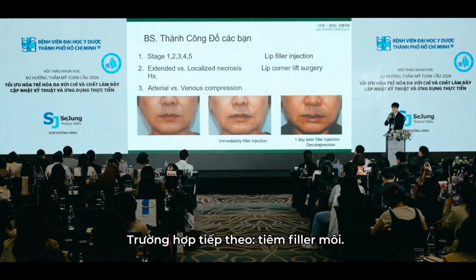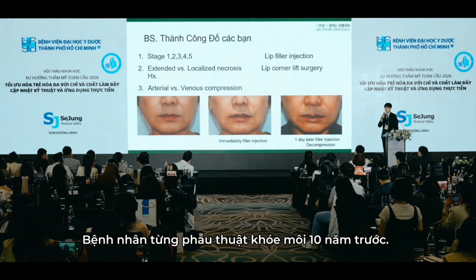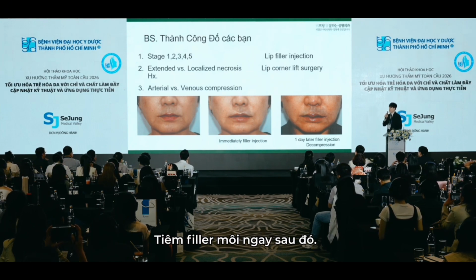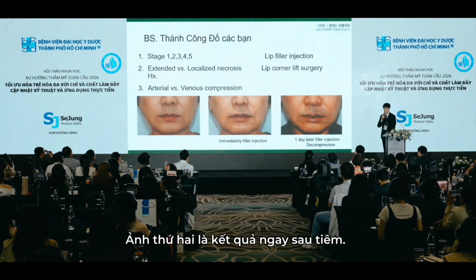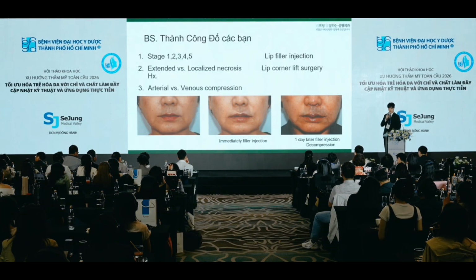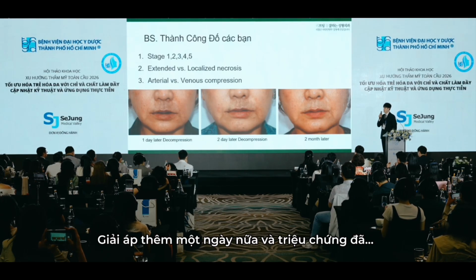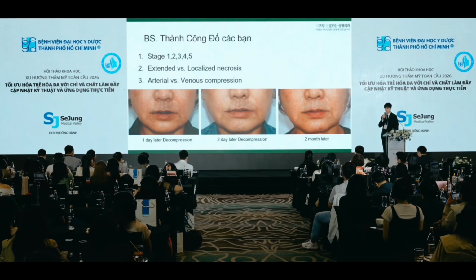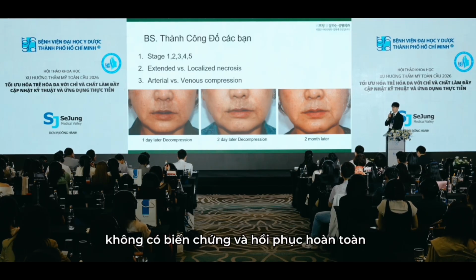Next case, lip filler injection. The patient had lip corner lift surgery 10 years ago. The second photo is immediately after filler injection. One day later, livedo reticularis appeared, and decompression was performed. One day after decompression, the symptoms released. Two days after decompression, and two months later, there was no complication and full recovery.